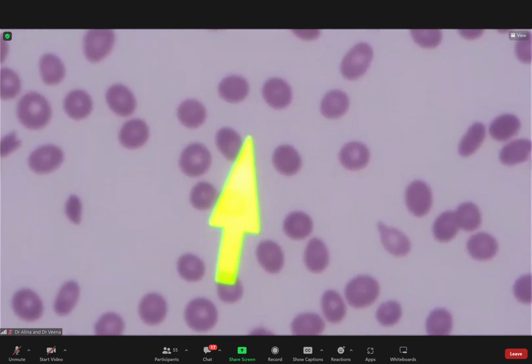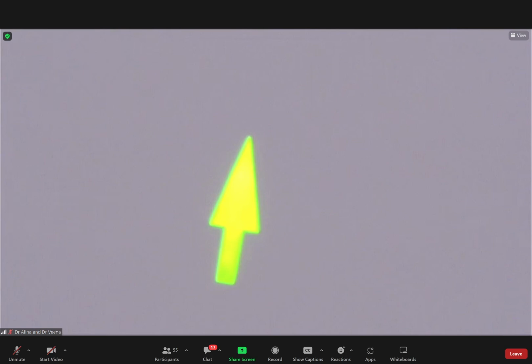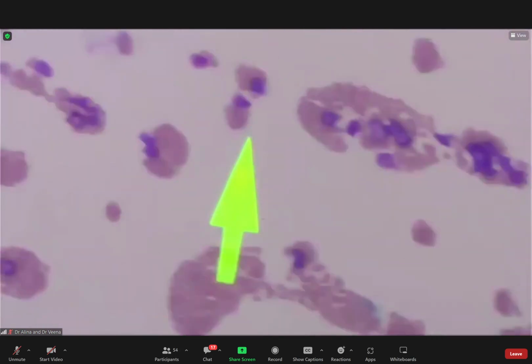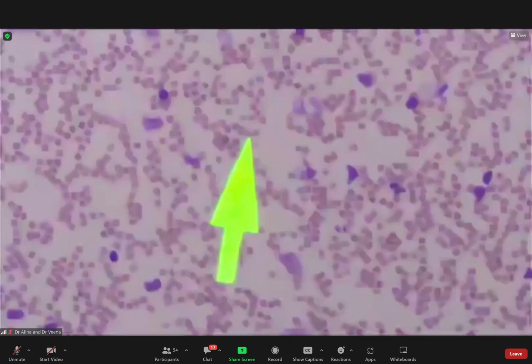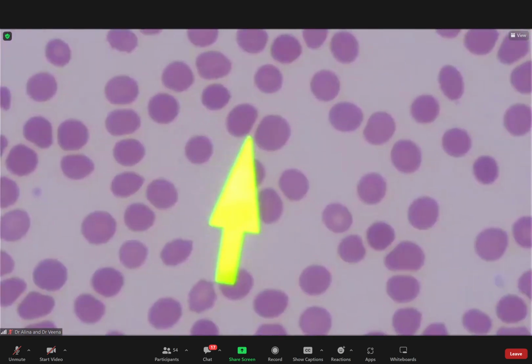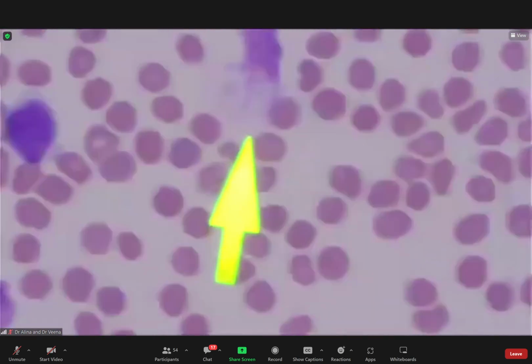Correct. Yes. Right. Okay. Last short case question before we move on to the long case. This is a case of a 45-year-old lady presented with leukocytosis for investigation. Okay, patient again has hyperleukocytosis. Okay, and they have blasts.